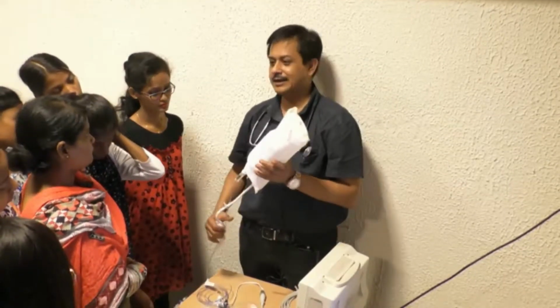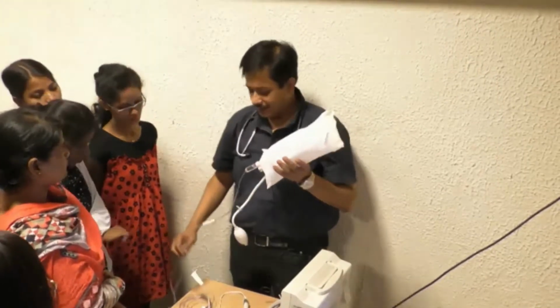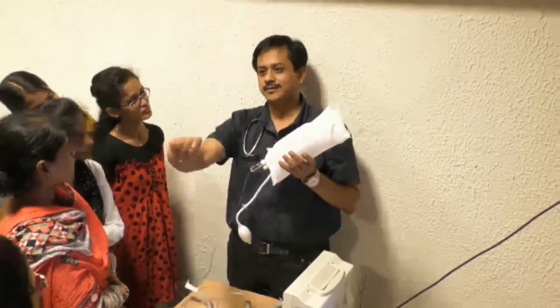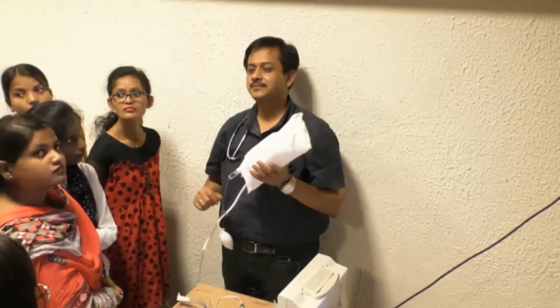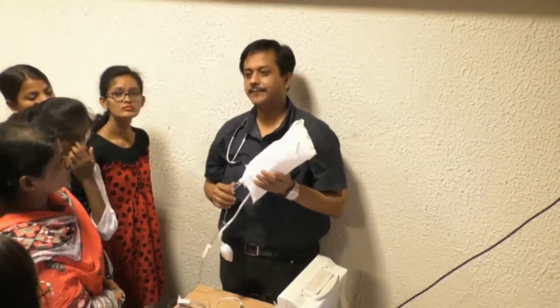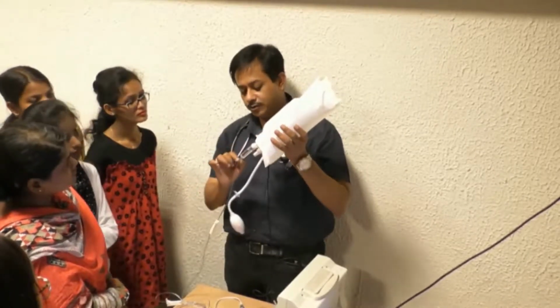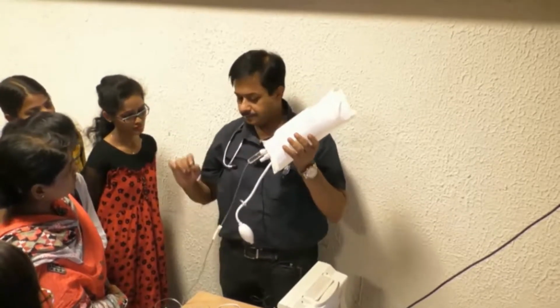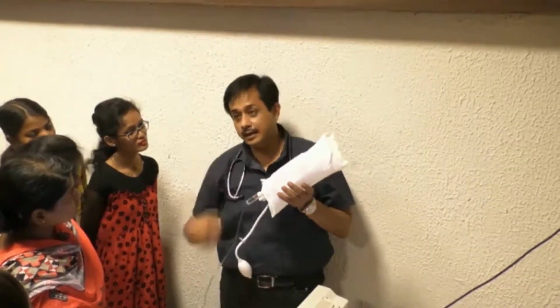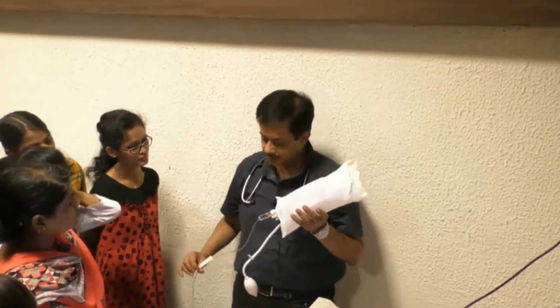Why do you keep pressure in here at all? Backflow. Okay, before that, let me ask you, is there any flow from this circuit, this system, into the line? Actually, we are measuring that exertion, meaning the pressure from the fluid column. That's why we are measuring the pressure from the fluid. This ensures, number one, that the system remains patent and there is a flow of around 3 ml per hour into the circuit, so that it doesn't get clogged. It's a very low flow, it will keep the system from clogging.